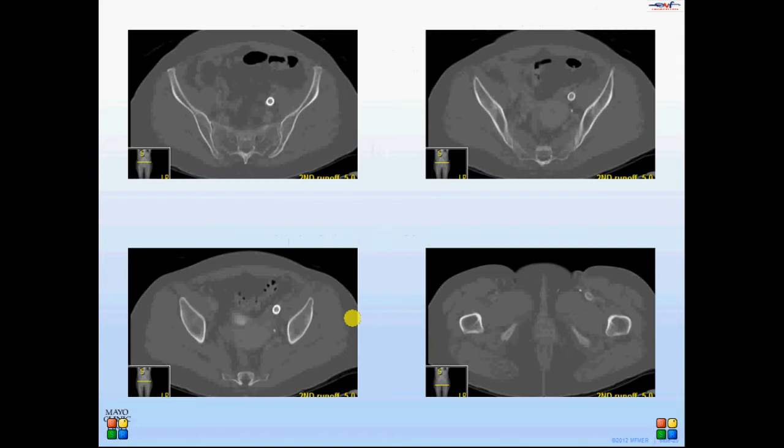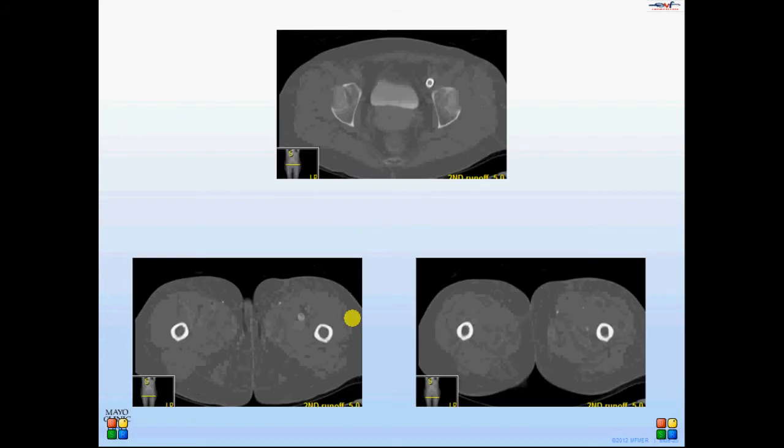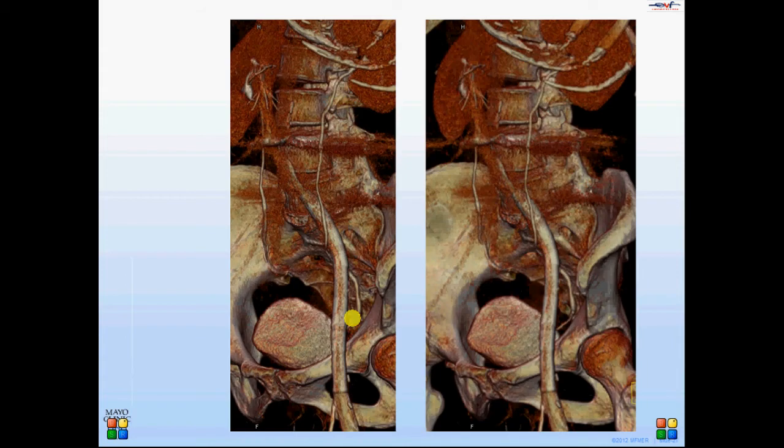CT. This just demonstrates a patient that we had stented into the profundofemoral vein, demonstrates an open stent all the way into the profundofemoral vein. You can see the greater saphenous vein here, and no filling on the right side, as this is injected directly into the affected limb.